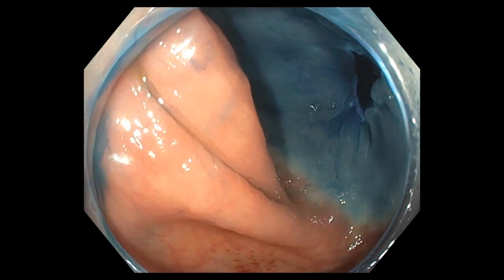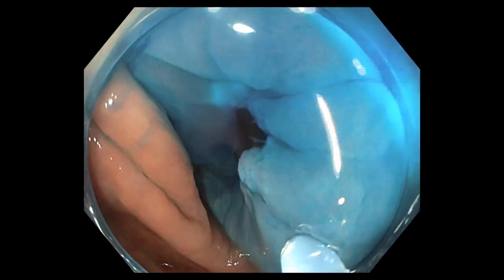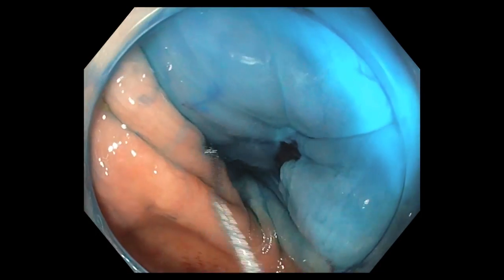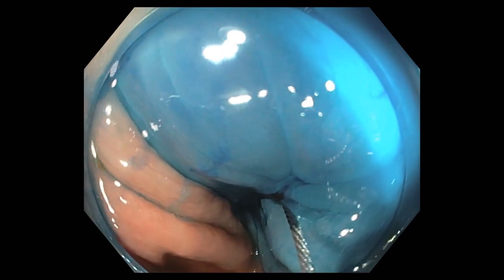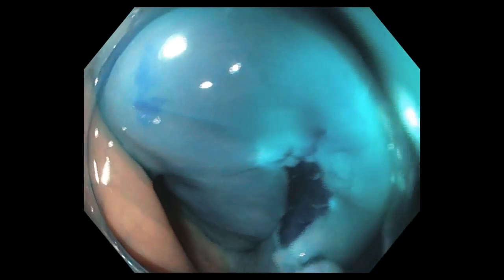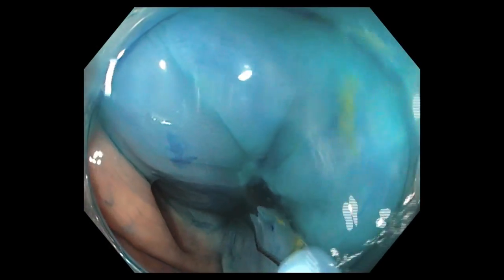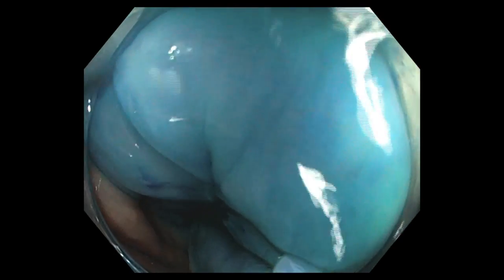In this case, there appears to be some residual polypoid tissue in the lower right corner of the resected specimen. We extend our resection using a stiff, small wire loop, in this case without electrosurgical current. Our goal is to ensure complete removal of both the lesion and surrounding several millimeters of normal tissue.